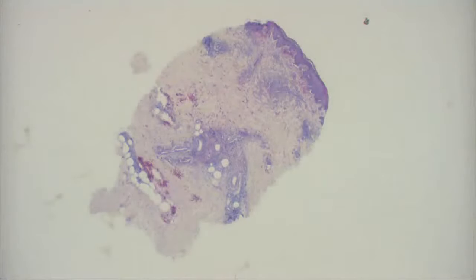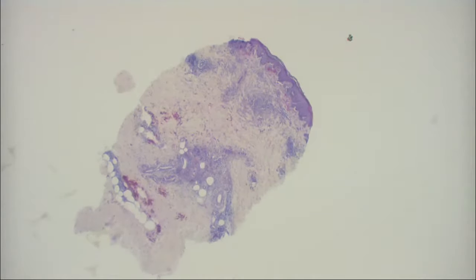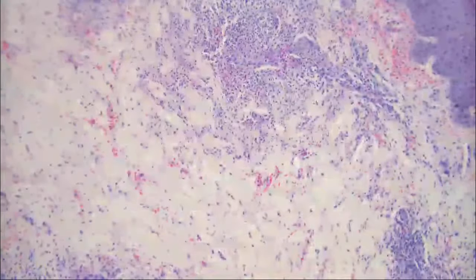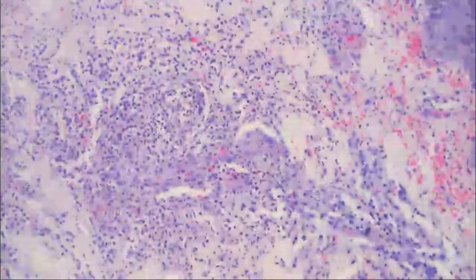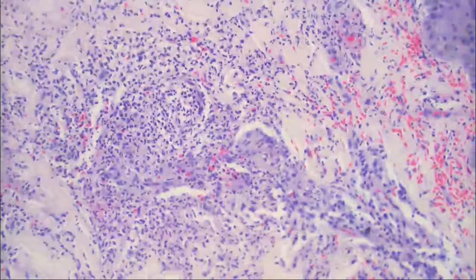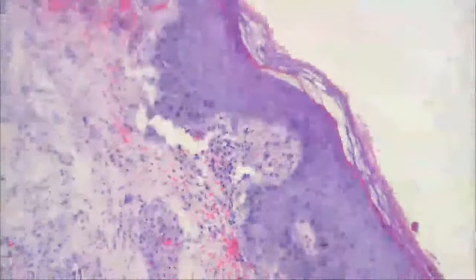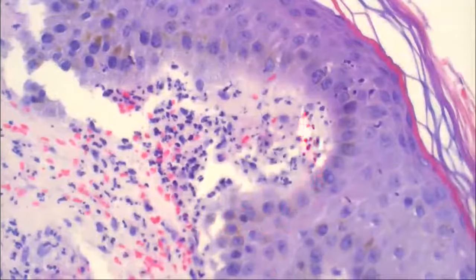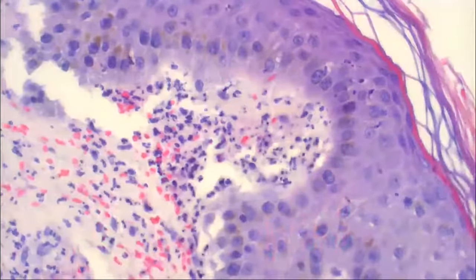Okay, who wants to give this one a quick go? So this is a punch biopsy. I thought that there was a superficial and deep lymphohistiocytic infiltrate. Was everything lymphohistiocytic? No. Good answer. What other kind of cell was in here? Eosinophils. Okay, there were some eosinophils, and what else? Let me look. Red cells. Something else. Neutrophils. Yes, neutrophils. And where are they located?